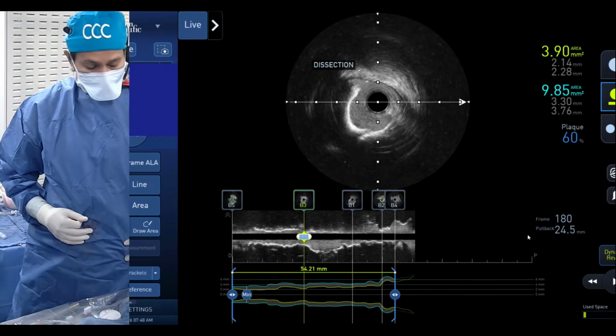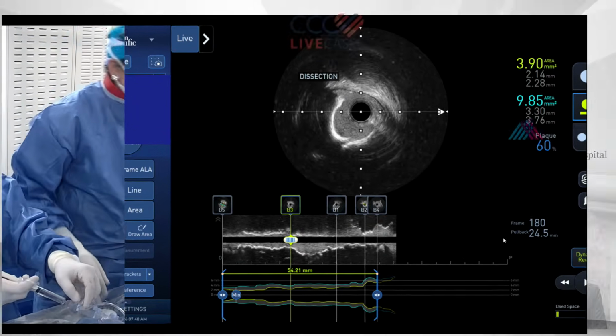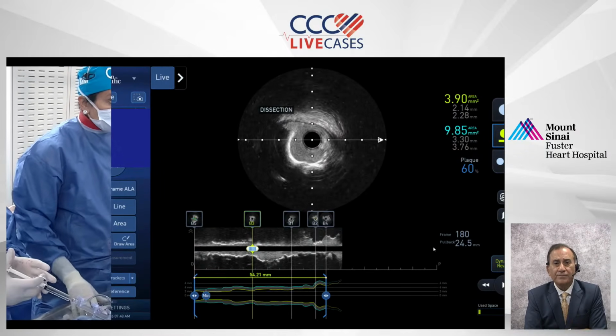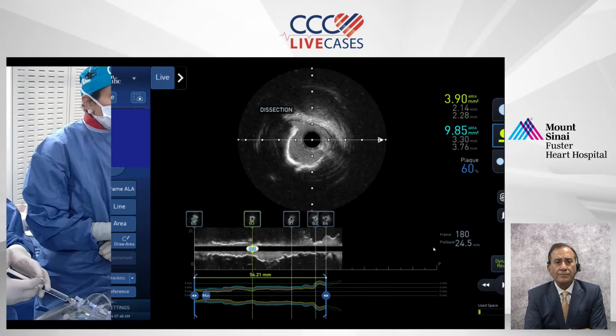Outstanding. Anu, great demonstration, wonderful discussion. Samin, probably time for you to jump into your presentation. Yeah. Let's take a picture and let's tell us what stent you are using.